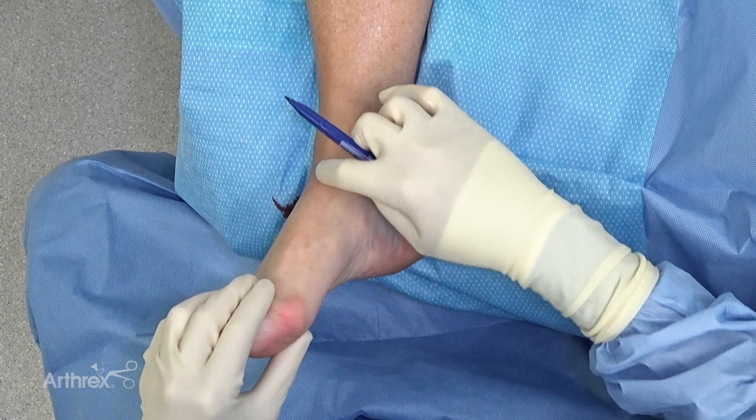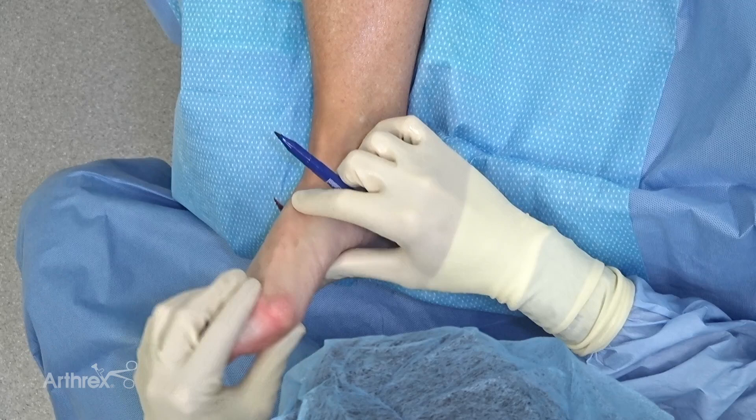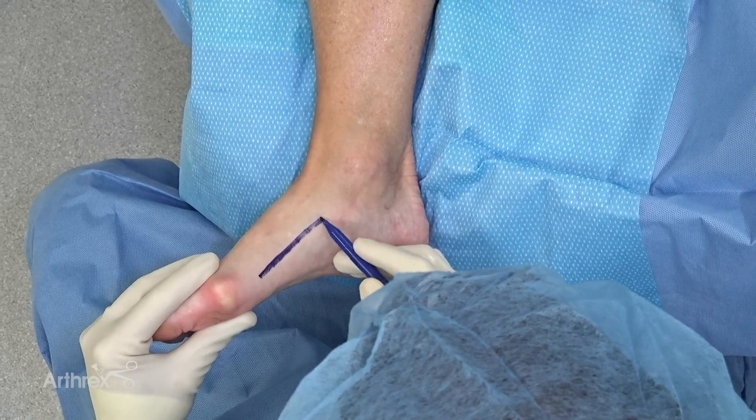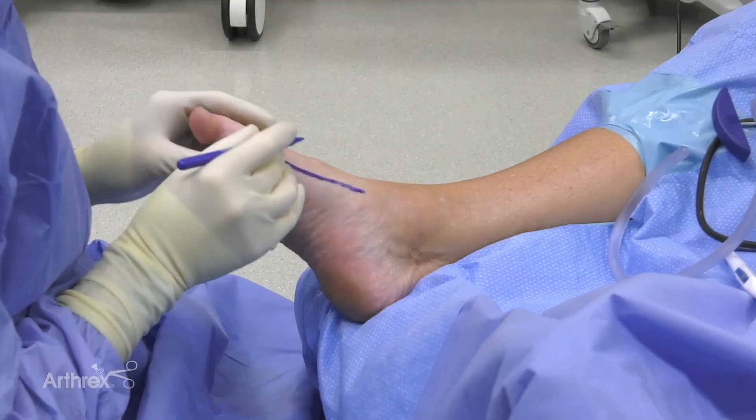For someone like this, I like to start by looking at the tibialis anterior, following the course down, finding the first TMT joint, and there's a nice junction between the dorsal skin and the plantar skin. So I typically come right along this area. Gives me great access to the plantar side. This area hides an incision really well and typically heals great.